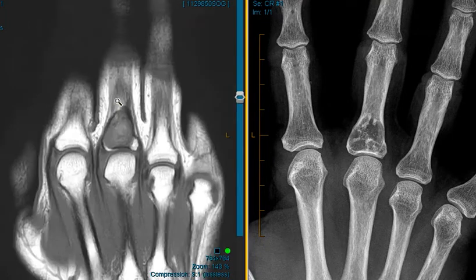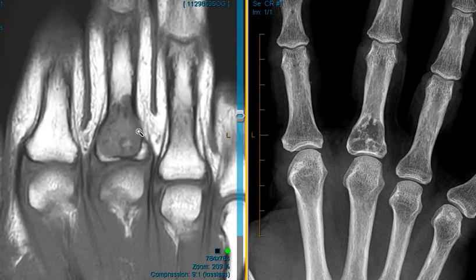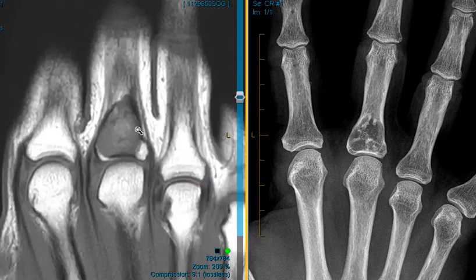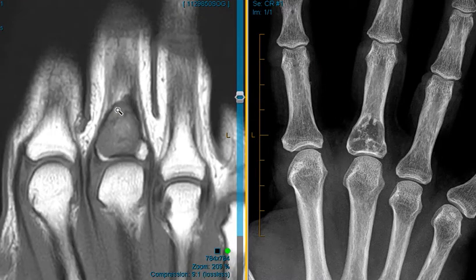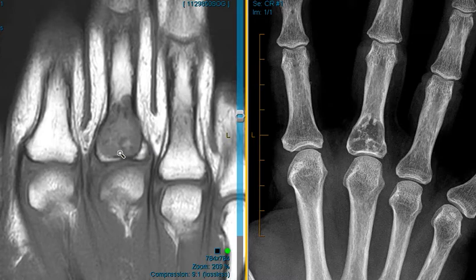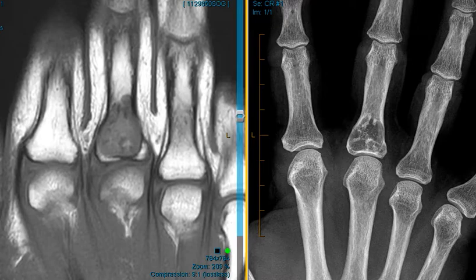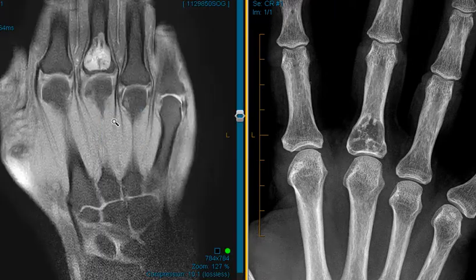On the MRI scan, I wanted to see this better. We can see that the margins are very well defined — there's a little black line indicating bone sclerosis or increased density. We see that with slow bone-growing tumors: they have enough time to develop that dark band around them, as the body puts a little bone density around the rim.